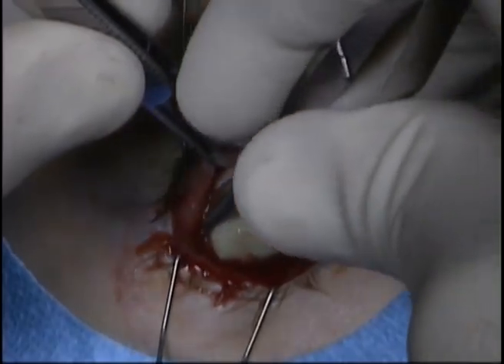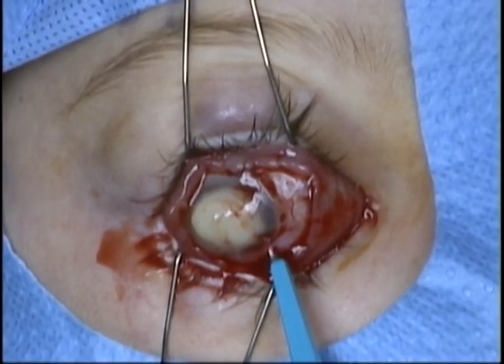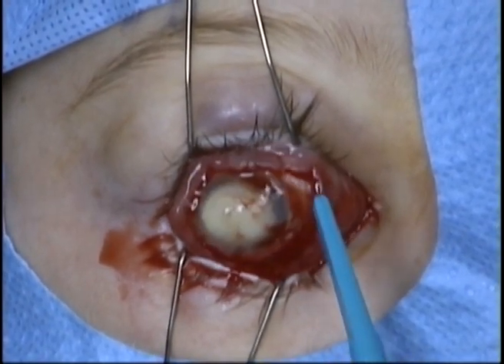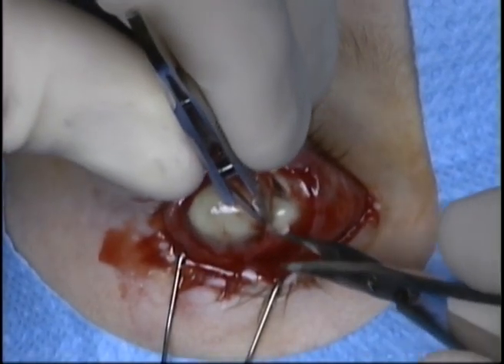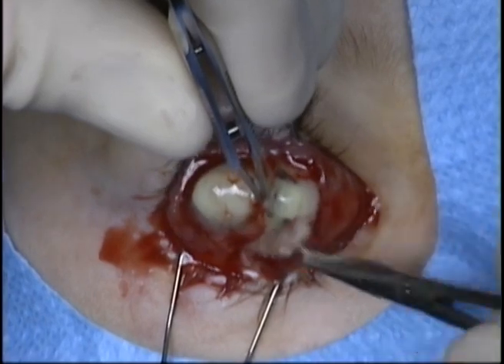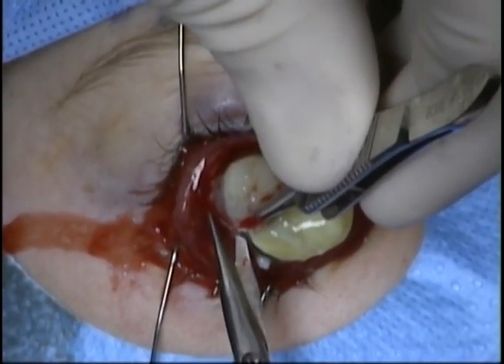A super-sharp blade is then used to make an incision through the sclera at the posterior limbus. Westcott scissors are used to complete a 360-degree incision at the posterior limbus. This can be performed with Castroviejo scissors if preferred.